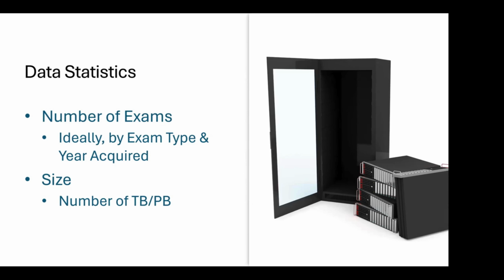So when you're assessing older data sizes, also consider things like image compression. So very old data may not be compressed. So some people will look at more recent data and just collect off of that, or only go back so many years when they're doing their statistical analysis. But you have to consider you may see variations as you go back. It's not converted.